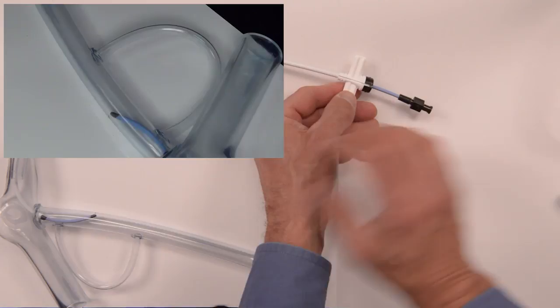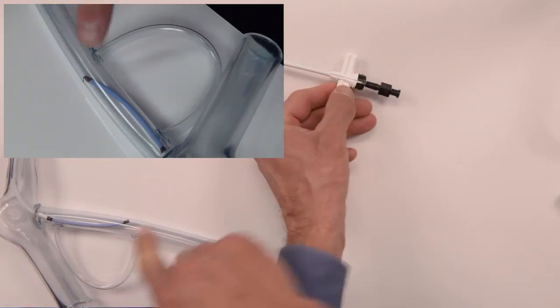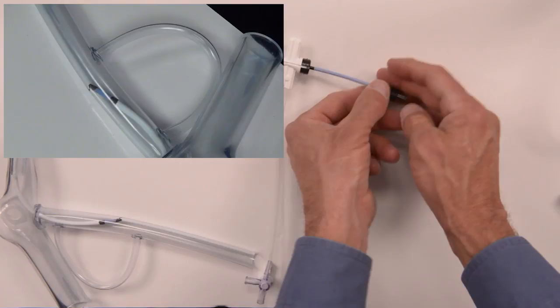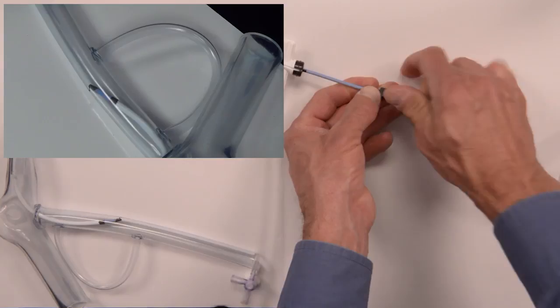Once I'm in, I can put that braided core into the coronary sinus and advance the CSG over that. The nice thing about this contrast administration kit is it can be hooked to there to puff contrast to show that we're in the right vessel.